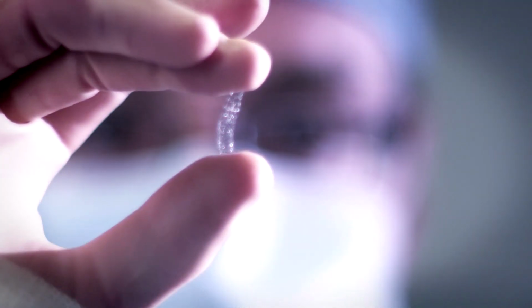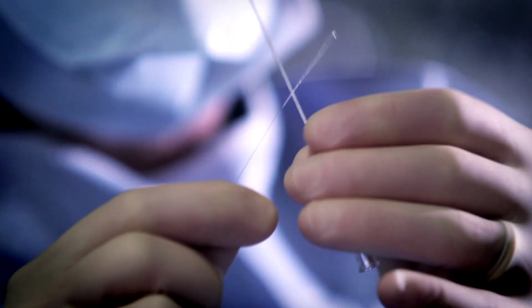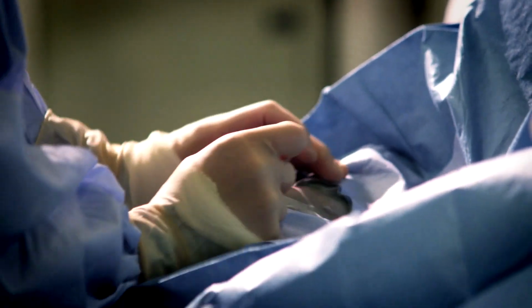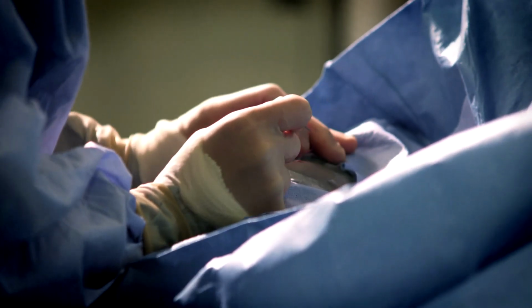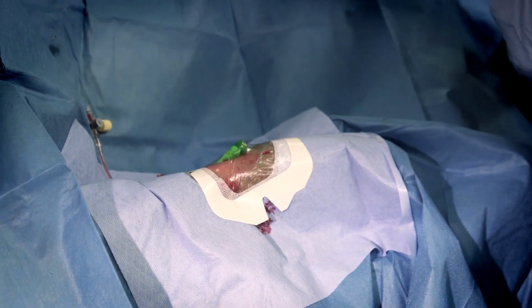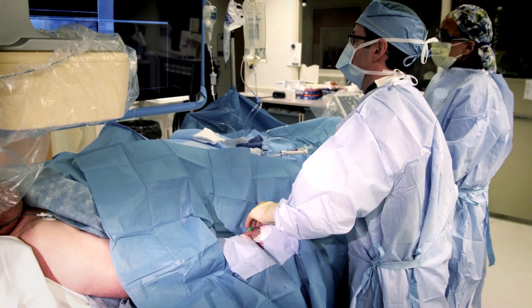As our equipment has advanced, we've realized that we can maybe do things one better. Now, oftentimes what we're doing is getting access in the radial artery, which is a small artery that sits right under the thumb. The radial artery is small, it's smaller than the femoral artery, and that would be a limitation in years past. But as equipment has evolved to the point where we're able to do complex procedures with smaller and smaller catheters, we can easily access the radial artery in a majority of patients.